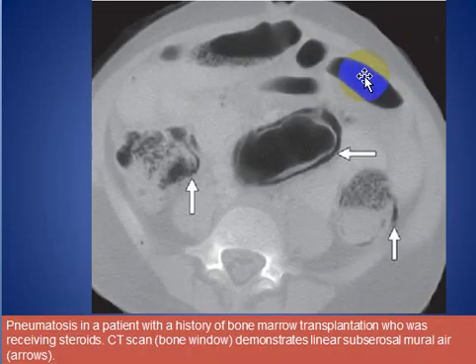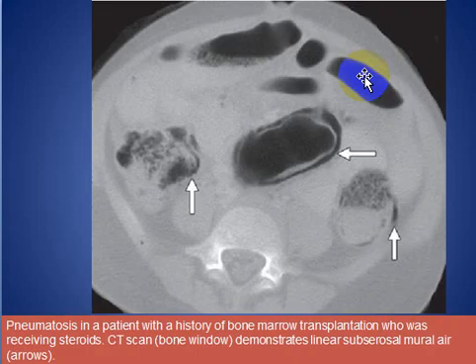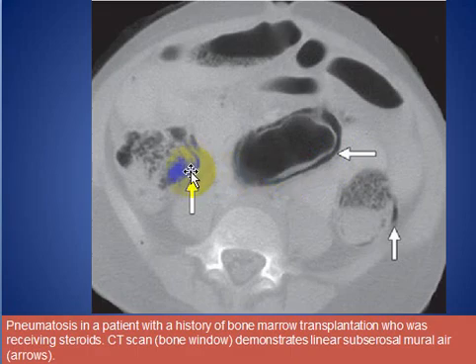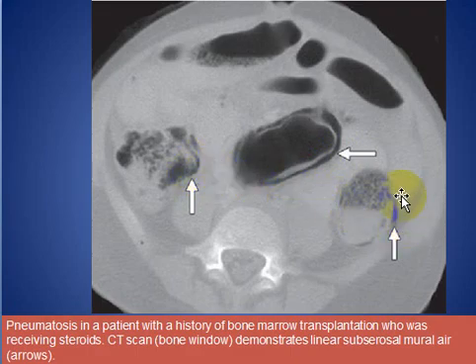Here is a patient with pneumatosis after bone marrow transplantation, with the patient receiving steroids. We see the pneumatosis as subserosal intramural air, also here and here.